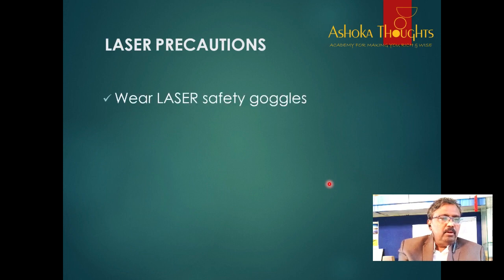What are the laser precautions? Wear laser safety goggles. These goggles must be according to the wavelength of your laser. If you are working in the infrared region, then your goggles must be blue or green. If you are using a 532 nanometer laser, then your goggles must be red.